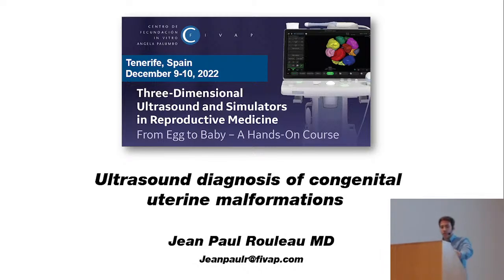I have no disclosures, and the learning objectives are to understand the pathophysiology of uterine malformations, to understand the uterine malformation classifications, to know the diagnostic techniques available for uterine malformations, and to learn how to perform a 3D ultrasound for the diagnosis of uterine malformations.